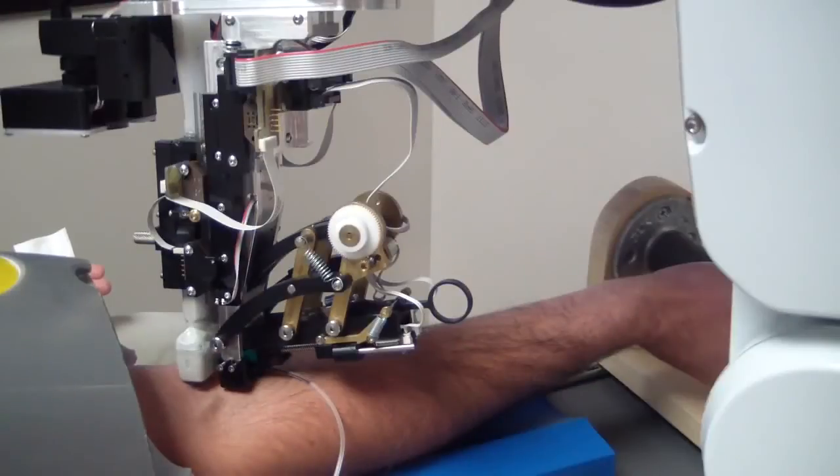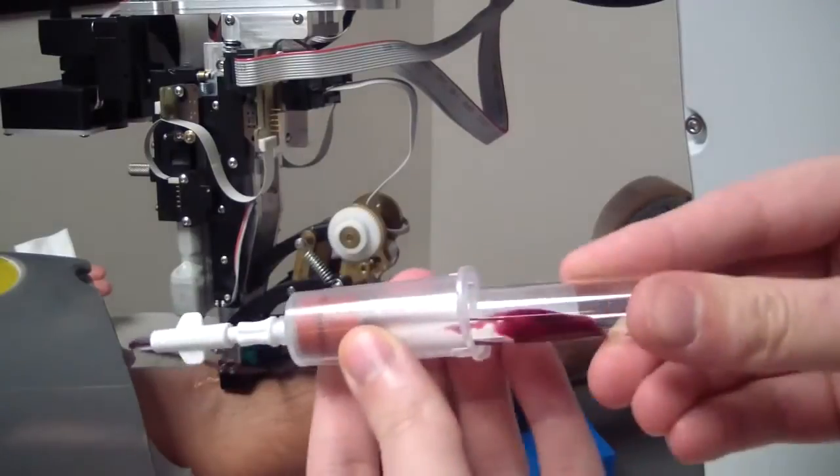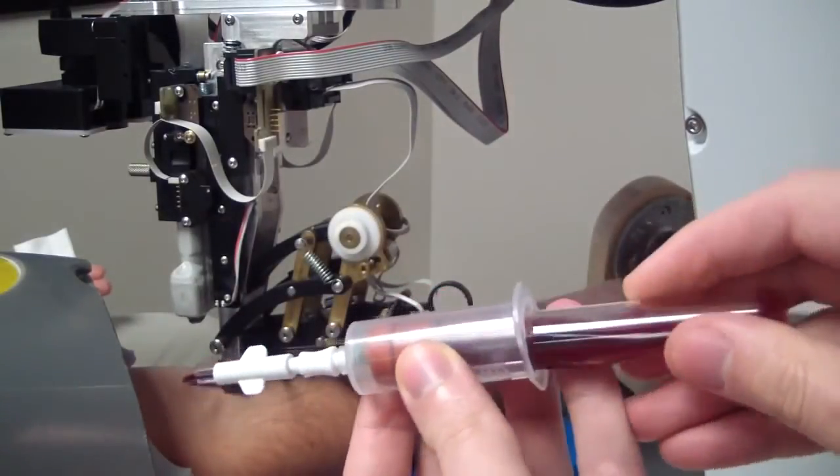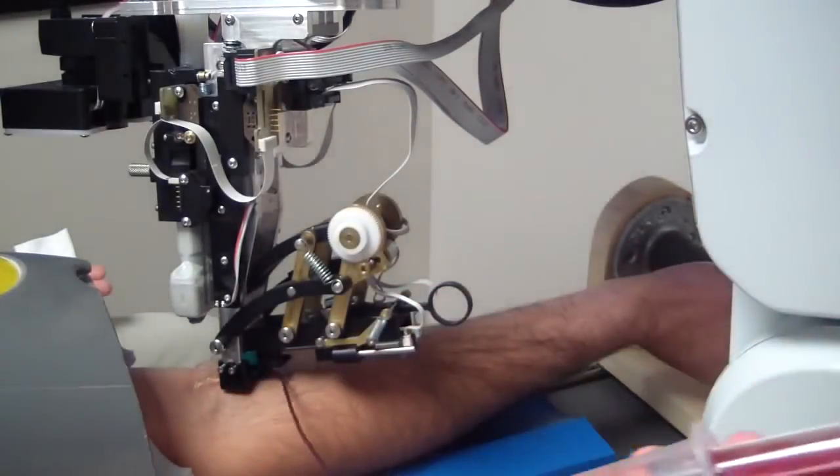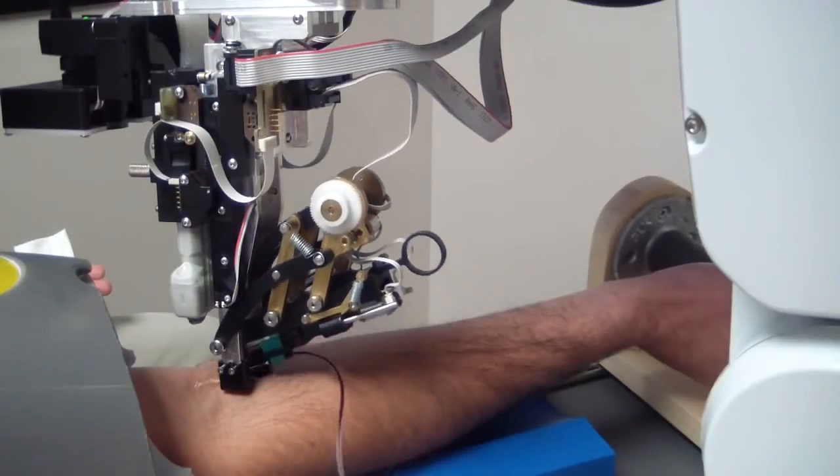Harris will have to conquer the creepy factor, but the effort is worth it. In the United States alone, there are a billion blood draws a year. That's a potential $9 billion market for robot phlebotomy.